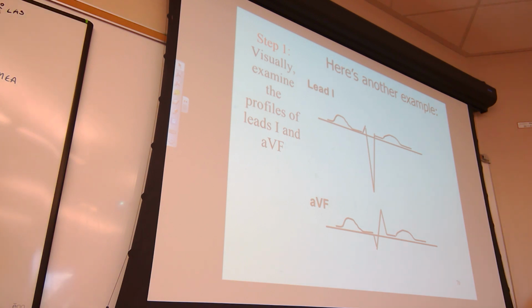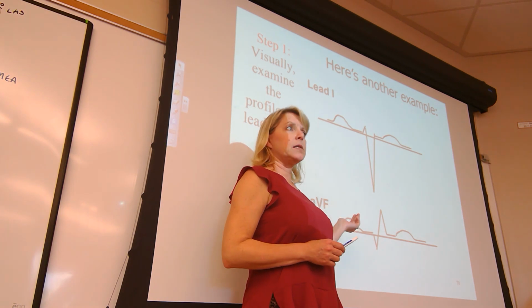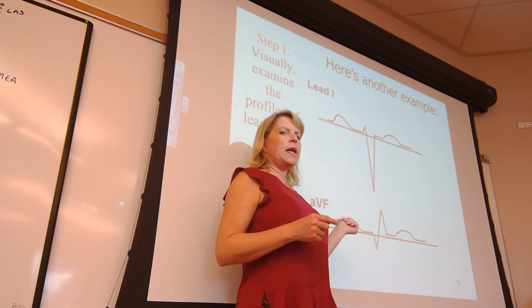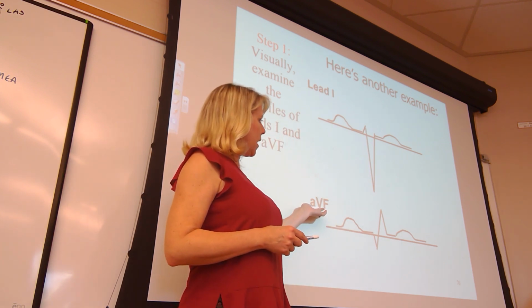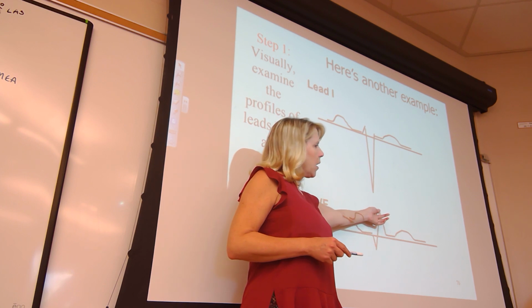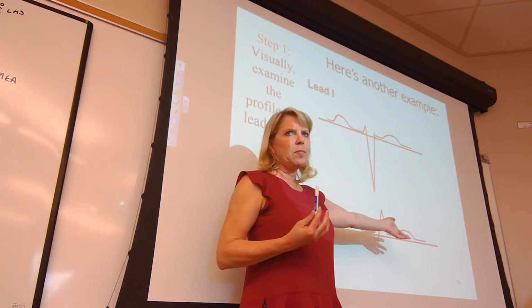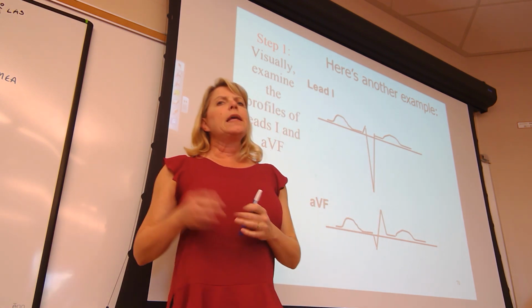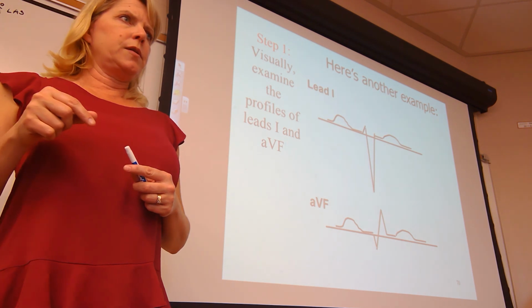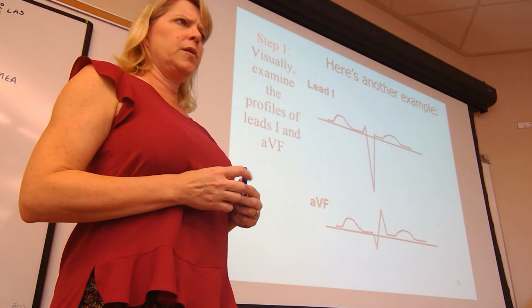Please remember that you measure the R and the S, not the Q. And I point that out because in AVF, notice the Q, notice the R, and there is no S. Nothing remarkable. And in your lab manual, it even says in your instructions to measure the R and the S. Why don't we measure the Q?